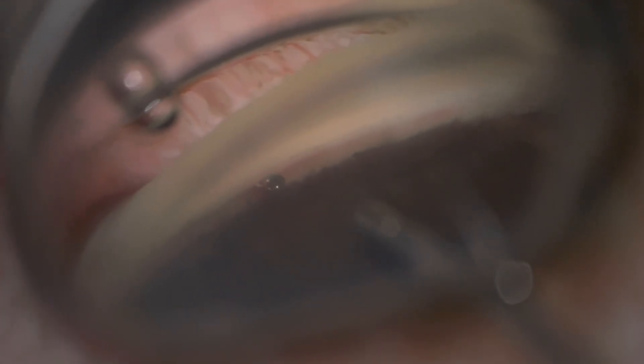So you can see here we're visualizing the trocar itself. And we aim for a junction of the upper third and lower two thirds. And we can plant the stent pretty well there. We get some reflux.